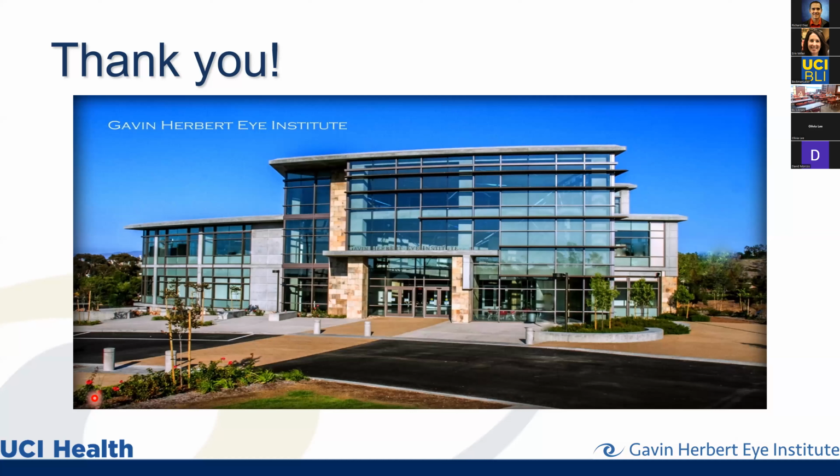Yeah. So for simplicity, we just try to always do central cornea. It's easier for the patient to maintain their gaze looking straight ahead. But because it's so highly magnified, it's true, we don't know if we're getting the exact same spot today as we do in 3 months. We don't have a good way to know that.